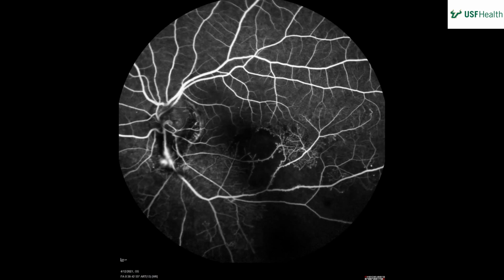And just to warn you, even though those vessels look funny temporally, and they do look like, wow, that might be neovascularization, the retinal vessels at the edge of an area of non-perfusion often remodel. So there's a lot of remodeling going on there. So I don't think that's neovascularization temporally. We'll see in the later frames, but that's probably just capillary remodeling at the edge of the non-perfusion. Capillary dilation. Yeah, compensatory, I think. The word I want. Dilation. All right, so keep going.